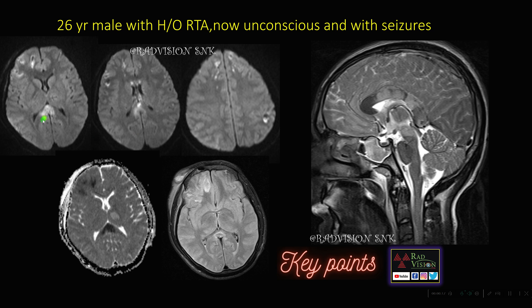Here you can see there is restricted diffusion on DWI noted in the splenium of corpus callosum, and even at some pericallosal area and in subcortical bilateral frontal lobes and even the left parietal lobe, with low ADC values. This was a case of diffuse axonal injury. Diffusion weighted imaging is a key sequence in helping diagnose diffuse axonal injury.